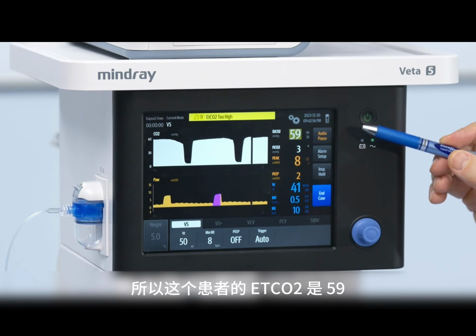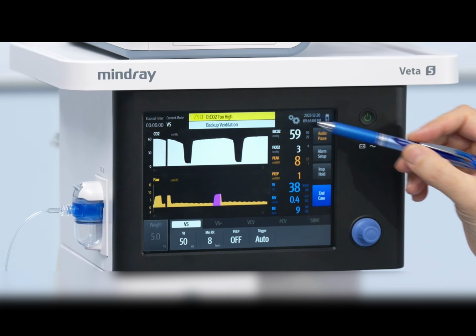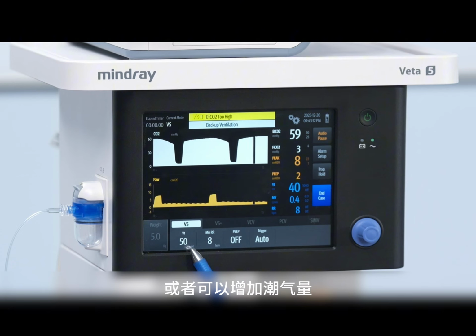So, the end-tidal CO2 of this patient is 59, which is high. So, this patient is hypoventilating. Let's try to fix it together. What are the options? You can increase the respiratory rate, or you can increase the tidal volume, or a combination of both.